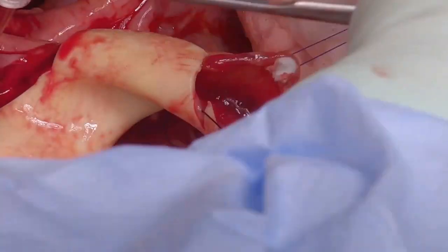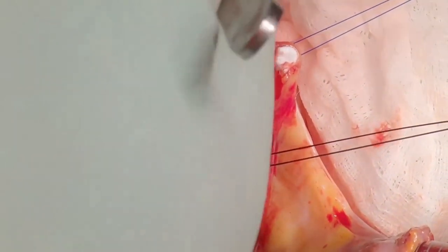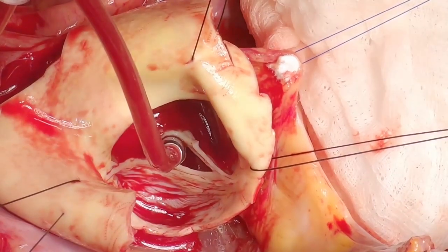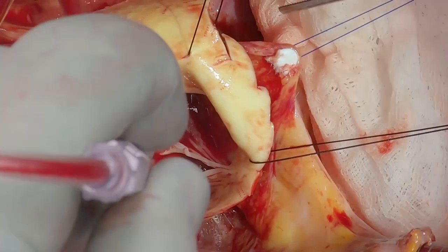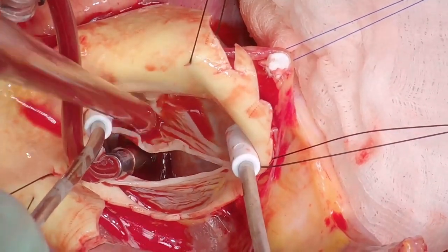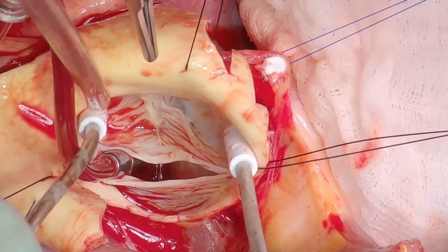An inclusion technique is used for the coronary artery — you don't excise the buttons as you would in a re-implantation operation, but leave them in place. Antegrade ostial cardioplegia is given to achieve cardiac arrest, since this patient had aortic valve regurgitation and a regurgitant valve.